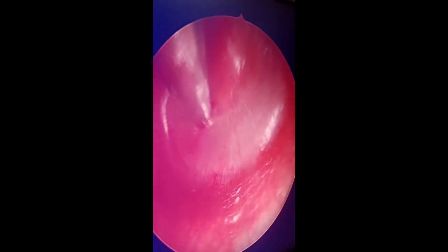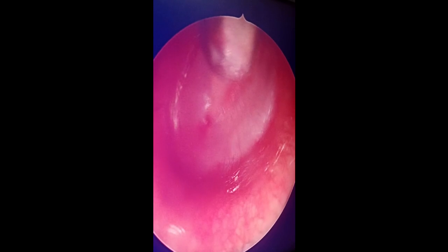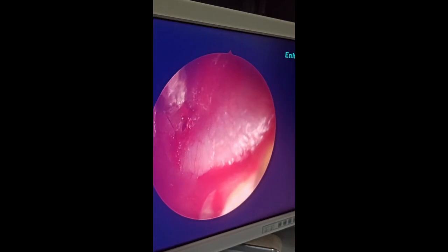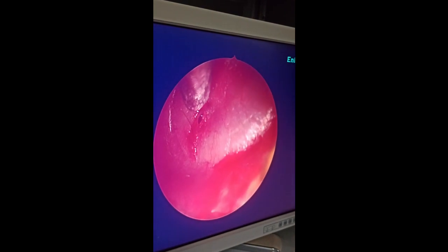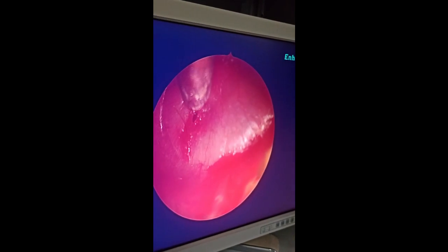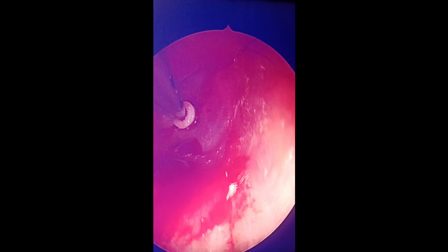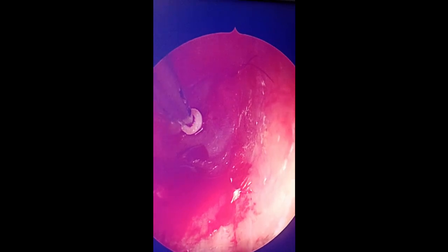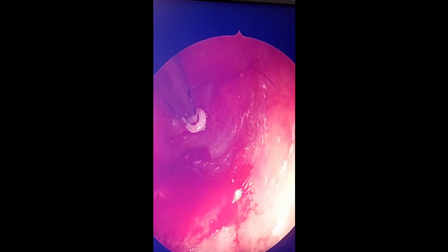the ventilation tube has to be inserted through the myringotomy incision. Catch hold of the ventilation tube using the crocodile forceps and push it through the myringotomy site, similar to putting a button through a buttonhole.